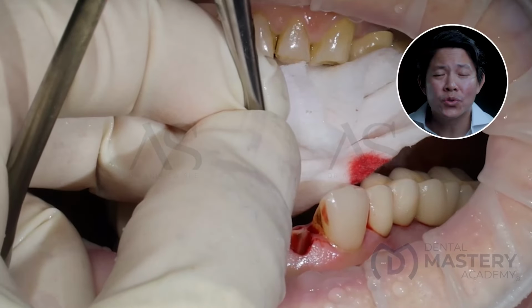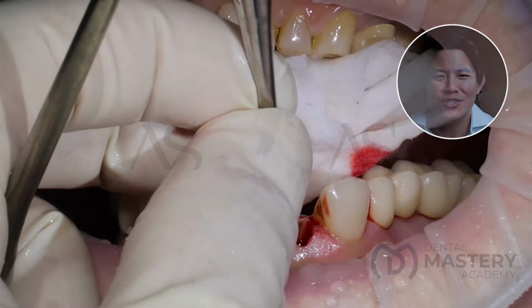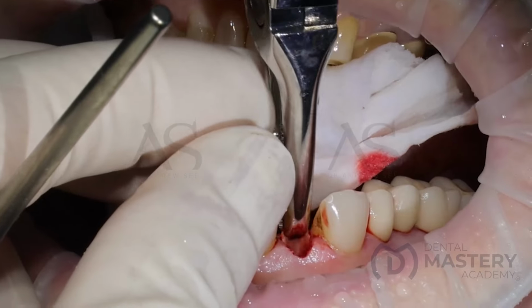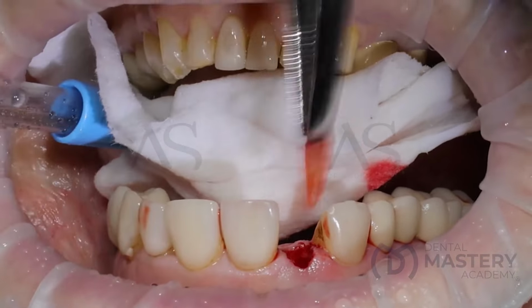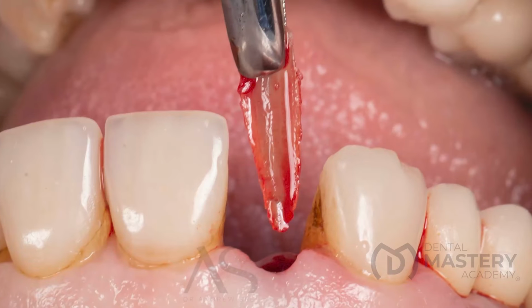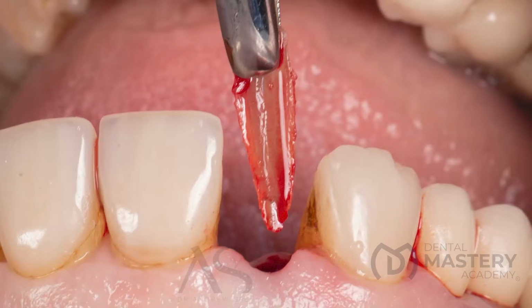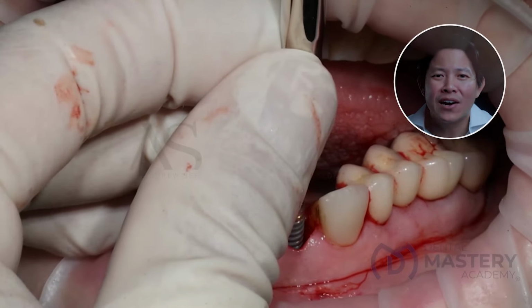After I've sectioned the tooth, I then remove the palatal portion to leave the tooth shield behind like you see here. Then we go ahead and place our implant behind the shield.